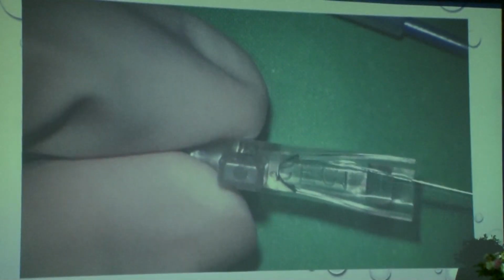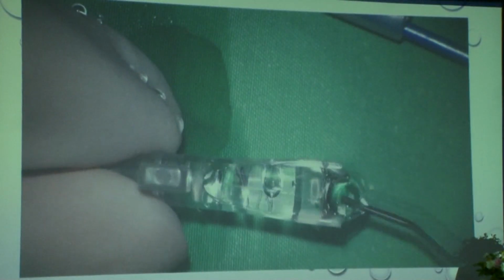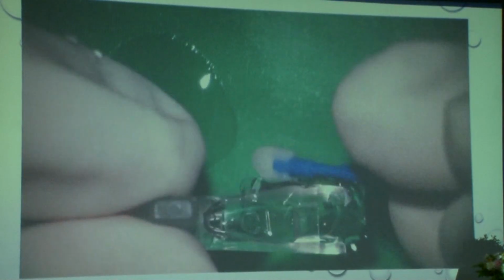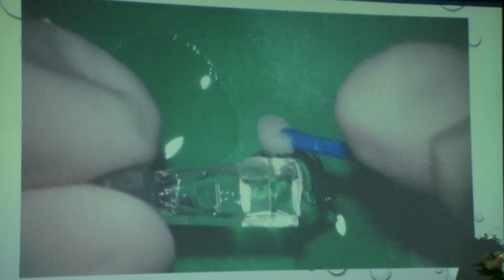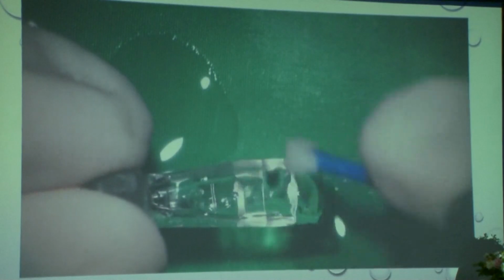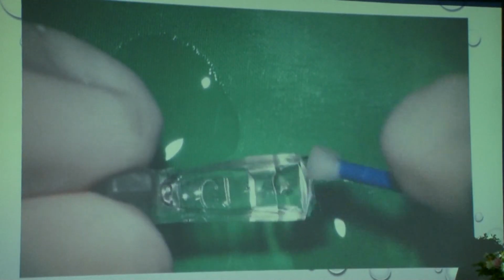This is a little detailed video because I wanted everyone to have a look. We first take the cartridge and inject the balanced salt solution, followed by a little bit of HPMC viscoelastic added. This is the ICL taken from the vial, and directly here you can see the orientation, the right upper side and the left lower side. There is a hole which tells us that the orientation is absolutely perfect, and it is tucked well inside.